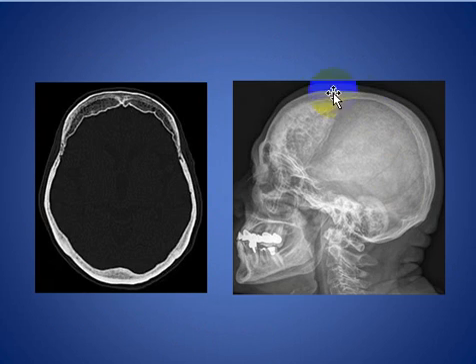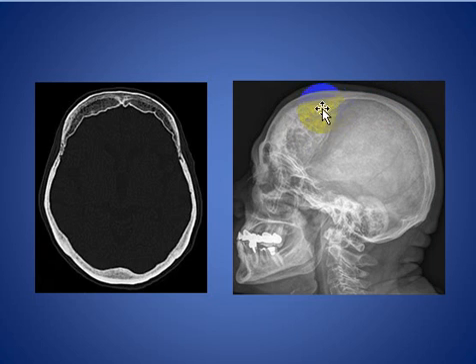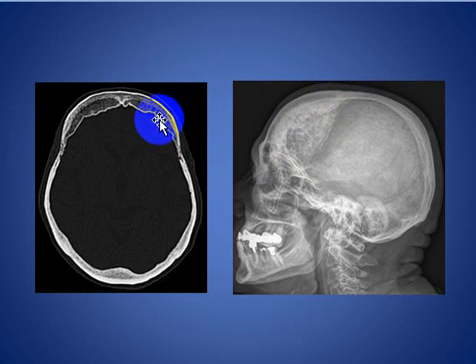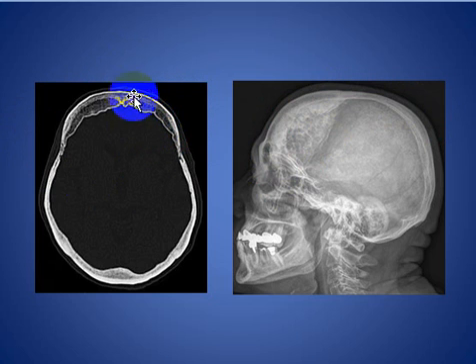As we see here on this lateral skull X-ray, there is diffuse thickening of the frontal region with hyperostosis, and it is limited by the coronal suture. On the axial CT scan, there is thickening of the bifrontal region, and it is usually symmetrical.